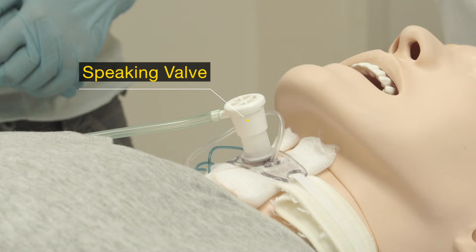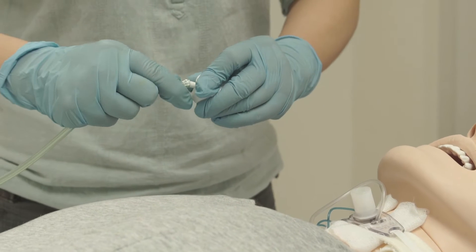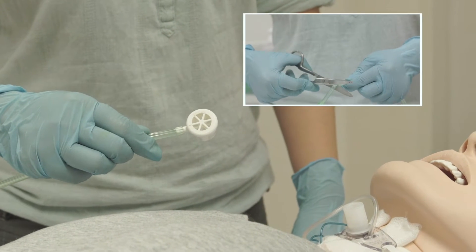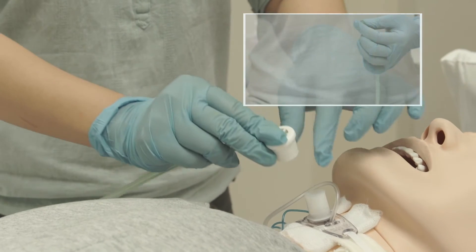Oxygen can also be delivered with the speaking valve. Connect the oxygen tube to the side port of the speaking valve. You may need to cut the oxygen tube, as the side port of the speaking valve is small.